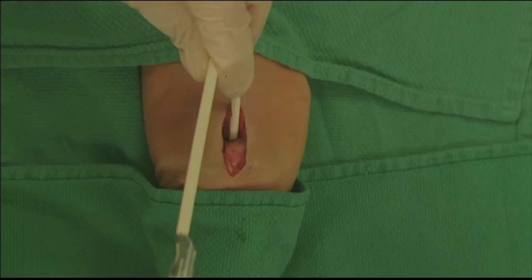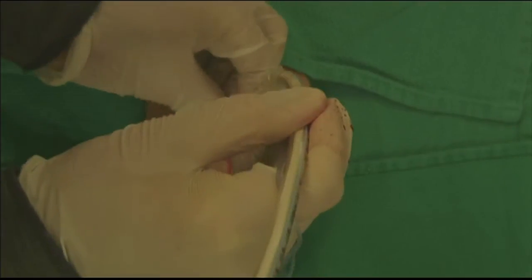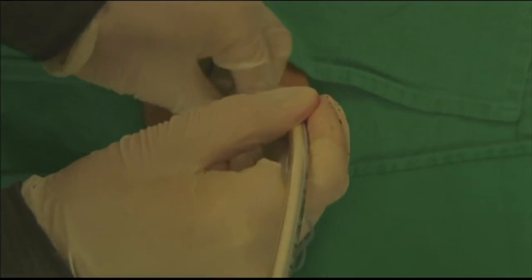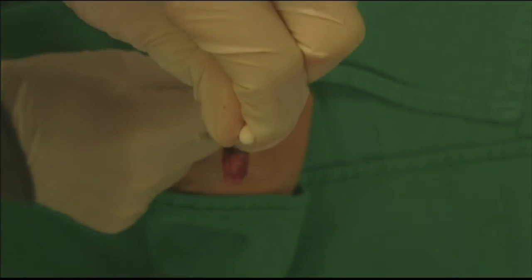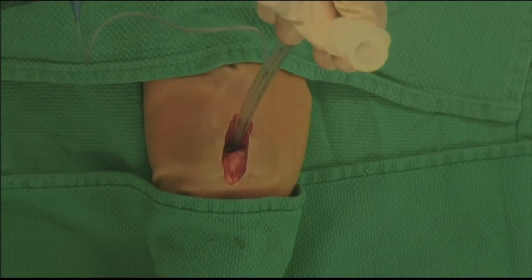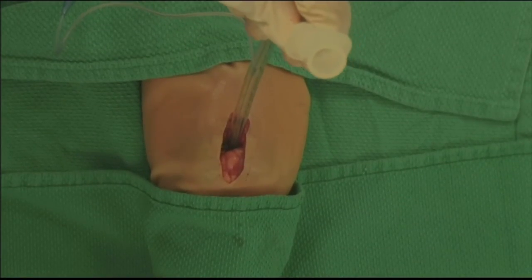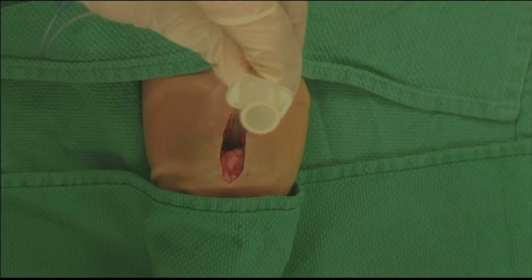Take your number six endotracheal tube with a little lubricant and feed it gently over the bougie. Bring the bougie back a little as necessary so you can grab it at the other end. Once you're able to advance the balloon just past the skin and the tube is in far enough, come out with the bougie and inflate the cuff. At this stage you're confirming intratracheal tube position by normal mechanisms — capnography, air entry, and so on. The final step, having done that, is to secure the tube in position and come up with a final airway plan. And that's it.